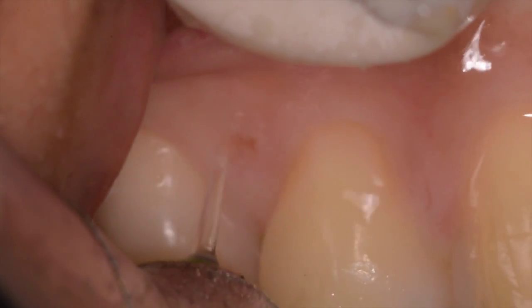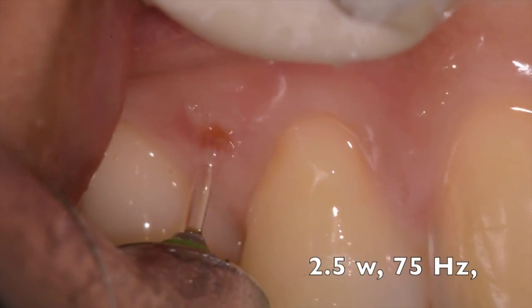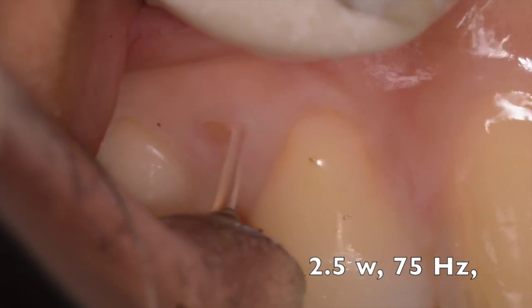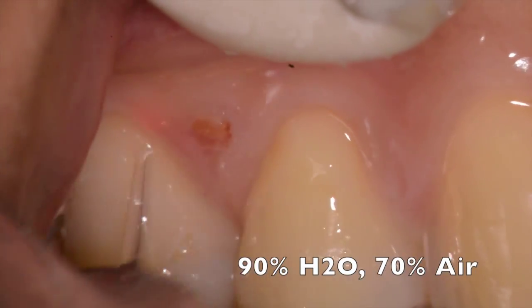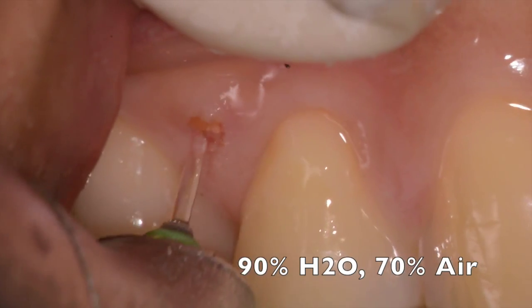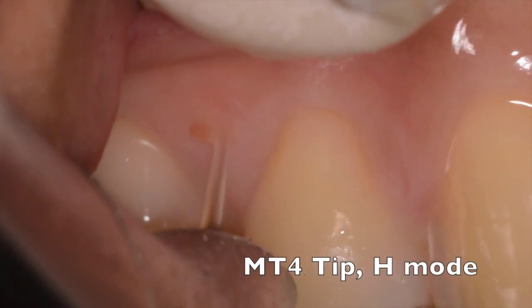You can see here the video with the I-plus laser being used, where we're using 2.5 watts, 75 Hertz, with copious amounts of water — 90 percent water and about 70 percent air — going in a circular fashion around the retained root to remove it.